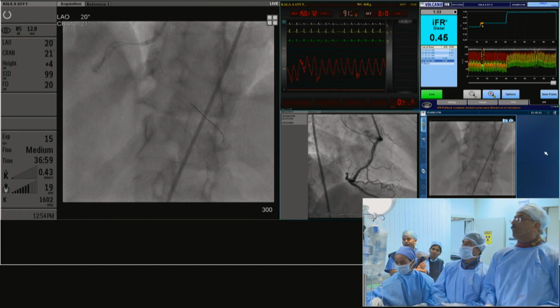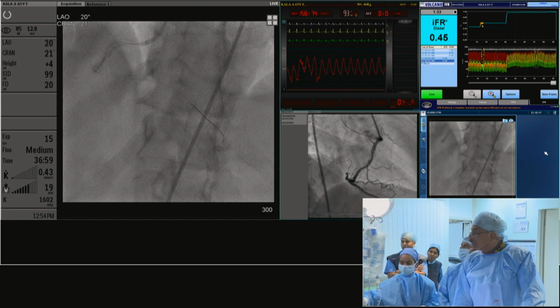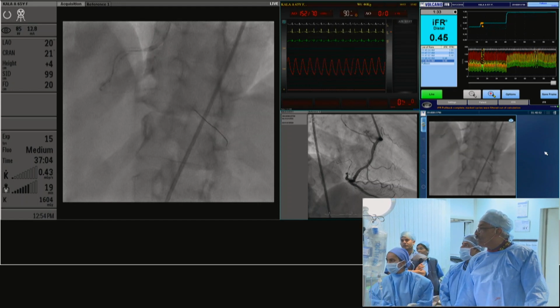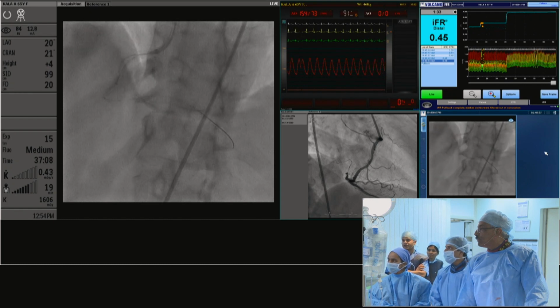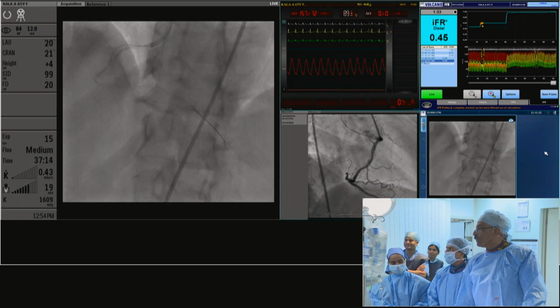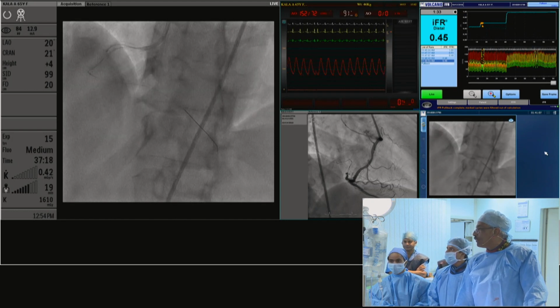I think 2 short stents may have tracked. That would have been an option. Yes, again, GuideLiner support may have been an option. But I don't disagree with treating the proximal just to get the mechanics of the intervention out. Another point, short stent may not be an option. If you see the IFR points, it was 0.45 distally and a 12 step up and a 38 step up.